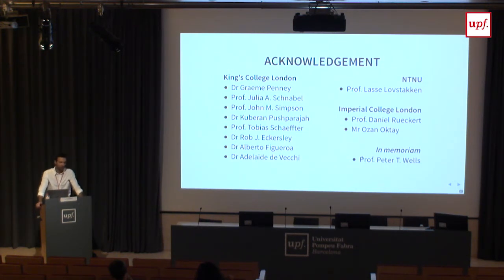So the first conclusion is, if you want to compare them just side by side, you will notice that MRI visually is much more pleasant. It looks much better, partly because it's smooth and nice. And I'm not totally convinced that this means it's also more accurate, or at least not for this reason. I think in general, it probably is more accurate than 4D flow from echo. So this is one thing.